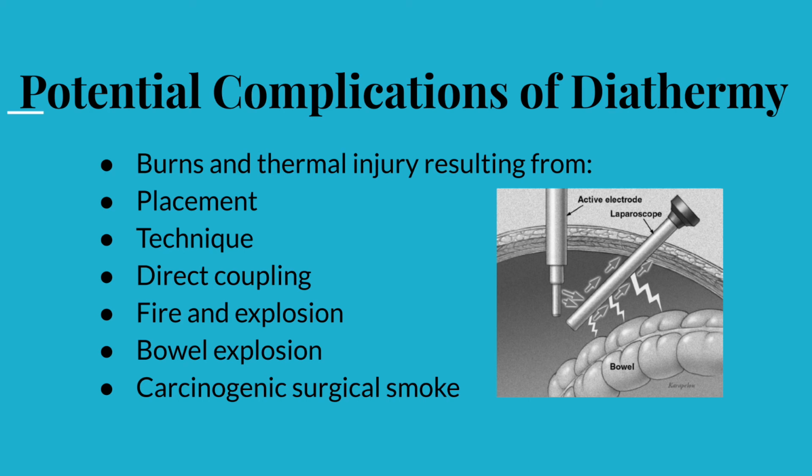Now let us focus on the incidence of direct coupling and what it actually means. Direct coupling is the case in laparoscopic surgery where there is an accidental contact between the diathermy electrode and the laparoscope, causing accidental burns to the surrounding viscera, such as the bowel walls, as shown in this diagram.